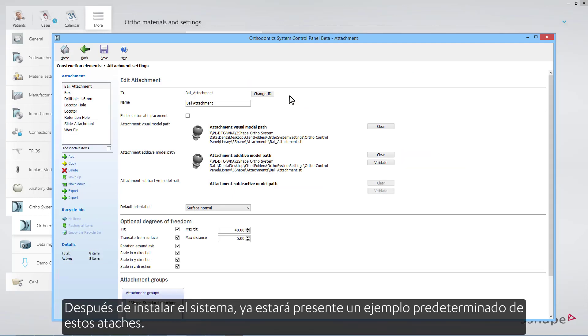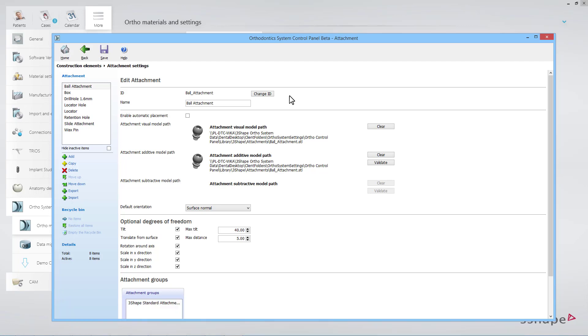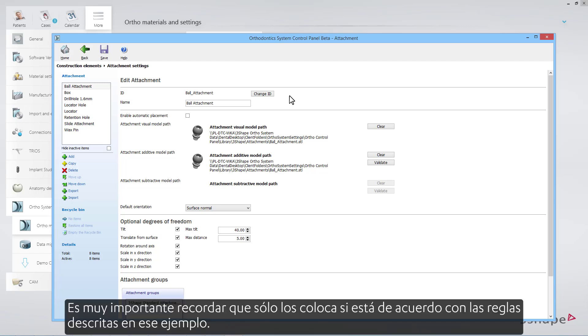After you install the system, a default example of these attachments will already be present. It is very important to remember that you only place them if you agree with the rules outlined in that example.